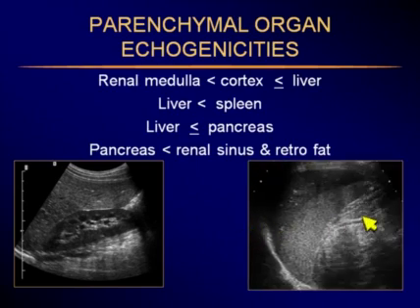That can happen sometimes. Now this is a scan of the left upper quadrant, and we're looking at the spleen here, and we notice that the spleen has sort of a double shade, has a darker area and a brighter area, almost like a double shaded spleen. However, we also note that there are some little vessels in this part of the spleen, not so much seen here. And then we realize that this is liver.